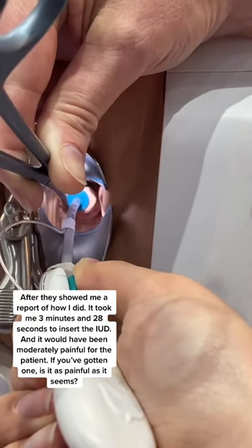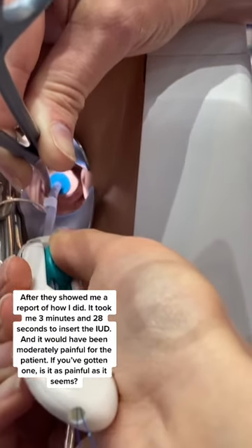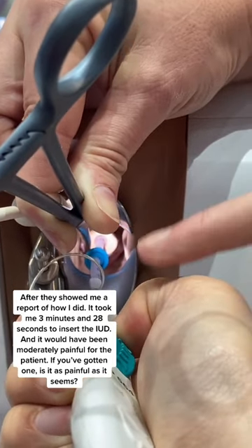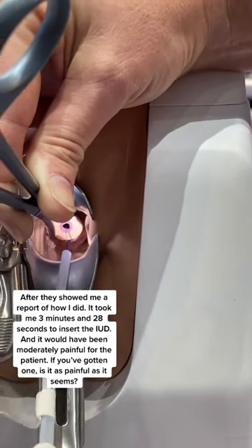After, they showed me a report of how I did. It took me 3 minutes and 28 seconds to insert the IUD, and it would have been moderately painful for the patient.